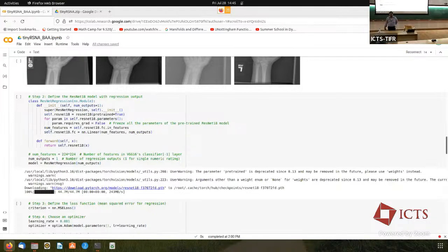Say you have trained this network on ImageNet. ImageNet is a large data set with all sorts of real world images. And you say that my images are not part of the ImageNet data set, but if a network has been trained to see lots of human recognizable images, and my data set is of a particular type, like a data set of different kinds of pen caps, right? So if a network has seen tables and chairs and birds and airplanes and so on, then recognizing pen caps is just a little bit more. So in that sense, you don't change all of the weights, you allow only these weights to change.